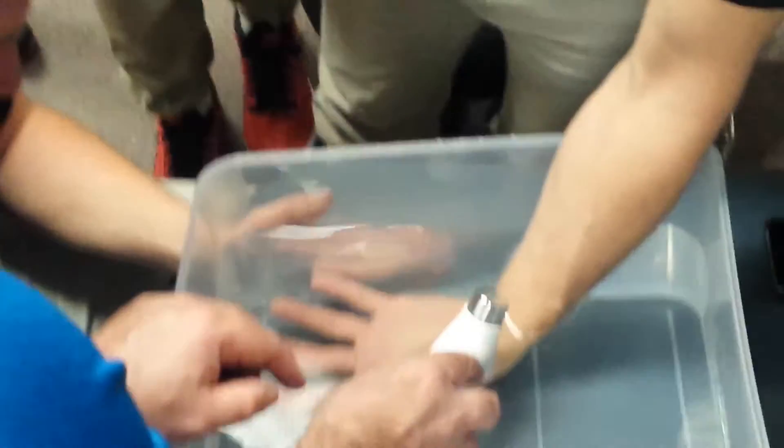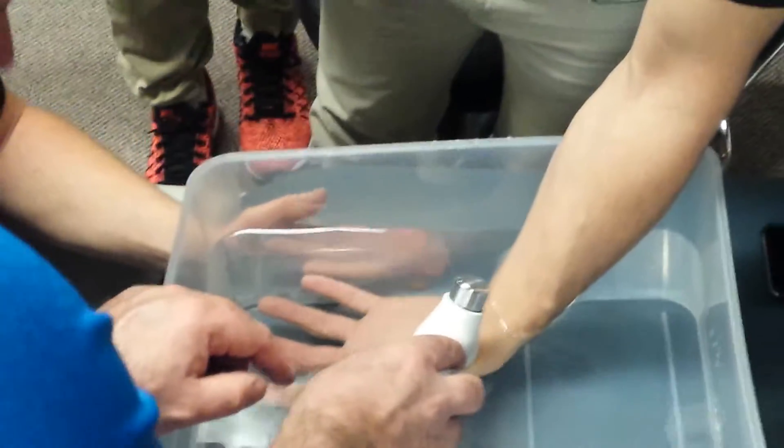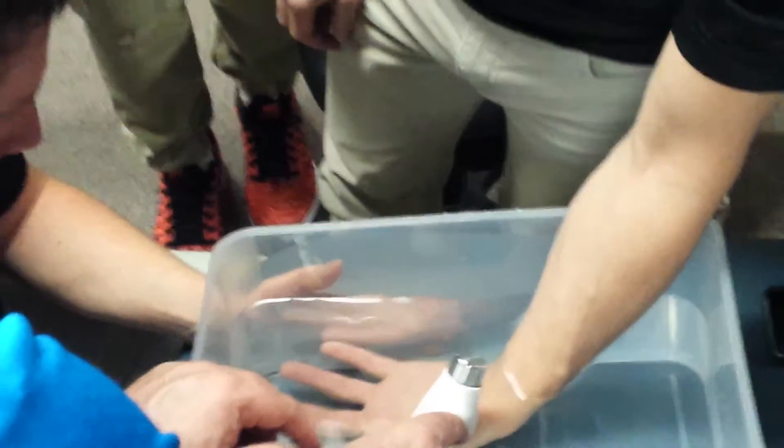Usually we do it on hands because we don't have good contact. No, I'm not touching it. Nice.